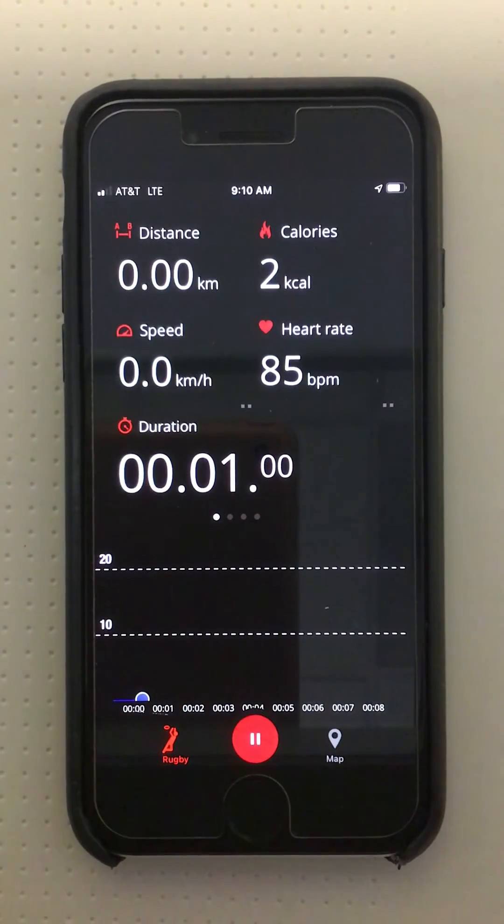At 80% heart rate max the heart rate text color will transition to yellow — we are right at the top of the high intensity training zone when the text is yellow. At 90% heart rate max the text will transition to red, which actually exceeds the high intensity training zone.